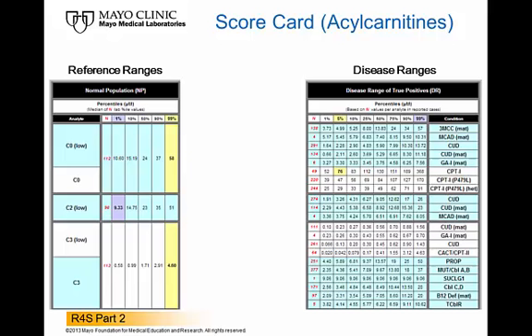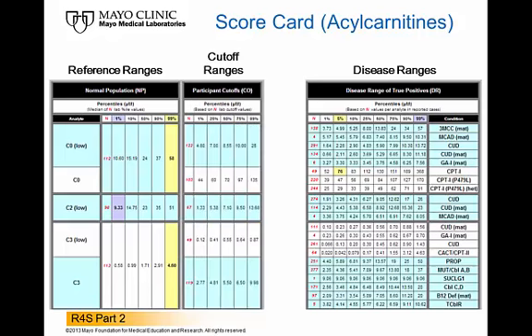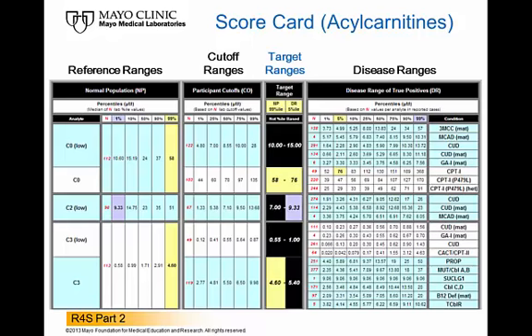This section is sorted by individual conditions and also includes 3 additional percentile values, the 5th, the 25th, and the 75th percentile. In the central portion of a scorecard, there is a summary of high and low cutoff ranges, and finally, the high and low cutoff target ranges. If needed, a detailed explanation of the color coding is included in the training material available on the website.